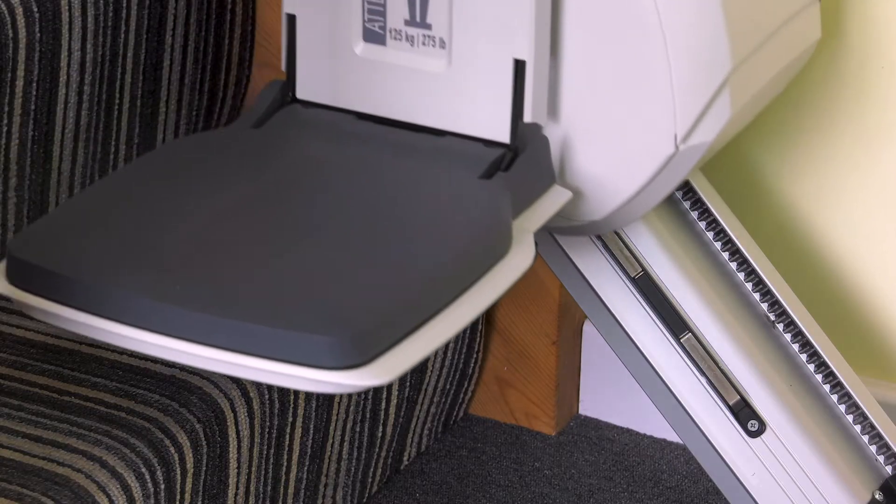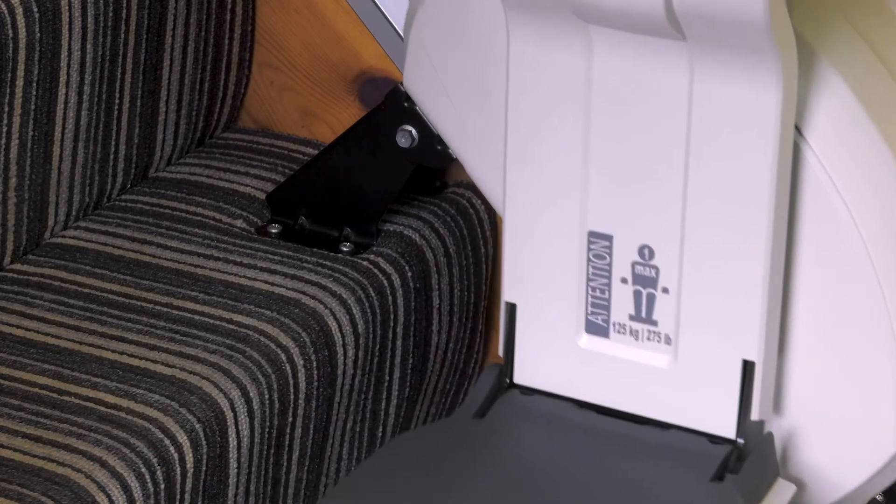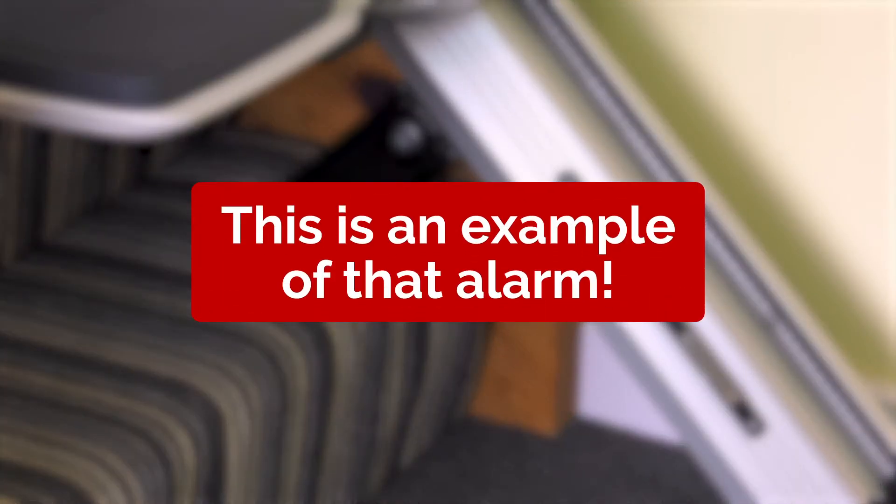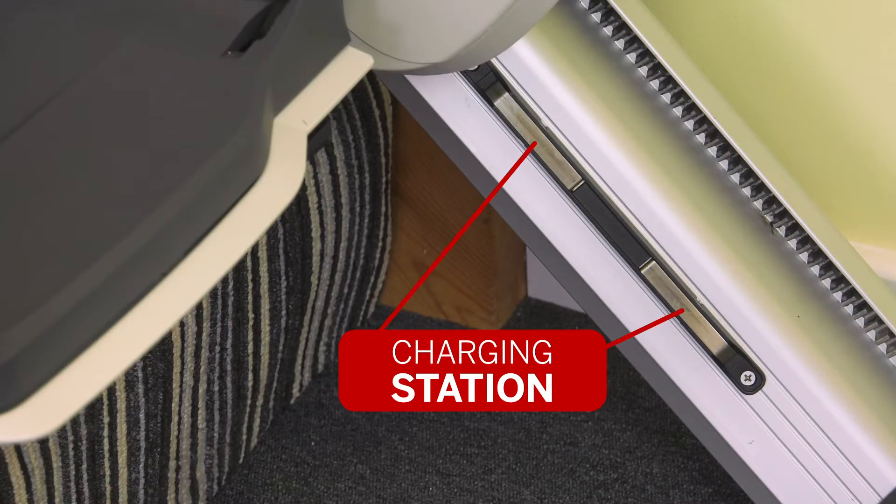All stair lifts are battery powered, so they work in a power cut and are charged by parking the chair on a charge station. Power is needed nearby to run the charger unit from the power socket to the rail charging system. If you are wondering why the stair lift is bleeping, that's the audible alarm telling you that either the lift is not on its charge station or the power is off.